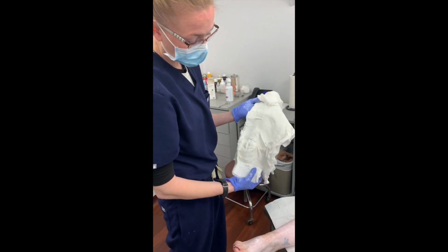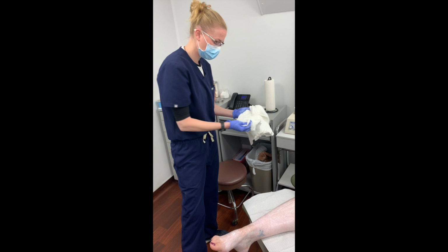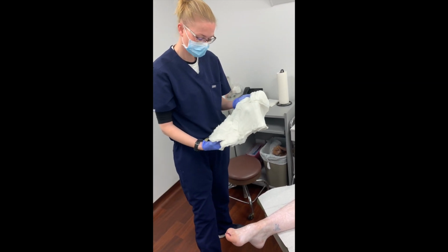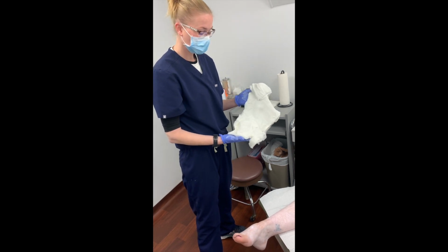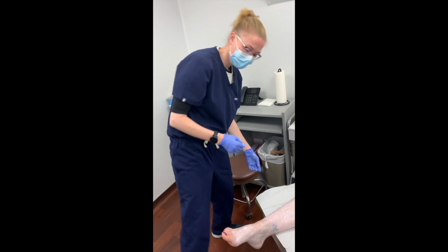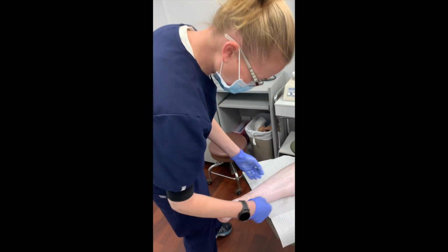So before you go to toss this out, either keep it on a chuck so that when the provider comes in, they can assess that, or double check with your provider before you go ahead and discard that. And then you can go ahead and clean the skin as normal.